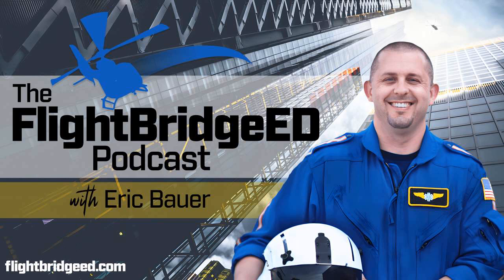Well, your blood pressure's in the toilet, and there's arguments for and against PEEP. And we talked about in the ventilator management podcast that your inspiratory maneuvers, how you deliver that breath, the volume that you give, how quickly you give the breath, recruits alveoli. Your PEEP maintains that recruitment. So, I always say PEEP is a good thing. We have intrinsic PEEP between 3 and 5 centimeters of water. And so is 5 of PEEP going to cause any increased pressure in the chest? It's going to reduce your hemodynamic status. Again, there's arguments for and against.